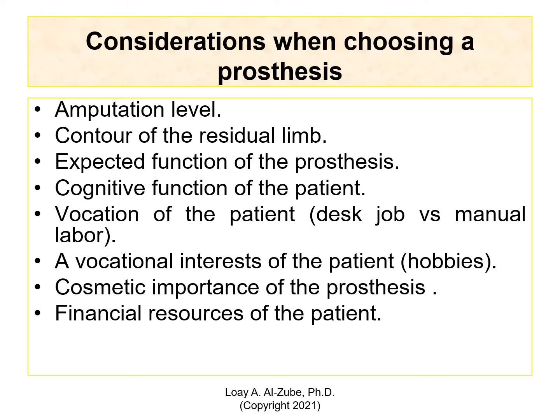Okay, financial resources of the patient, and that's an important aspect. And I'm going to share with you a website that develops prosthetics. You can download the SolidWorks model, you can print it, you can build it, and you can ship it to someone who actually needs a prosthetic arm, especially for kids. So again, in the United States, if you have an individual plan signed by the physical therapist and the engineer with specific outcomes, you can be reimbursed from your health insurance. Otherwise, you can't do that.